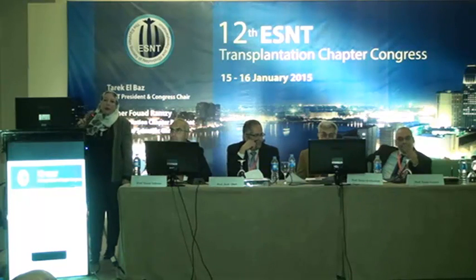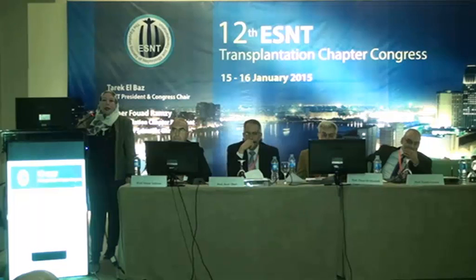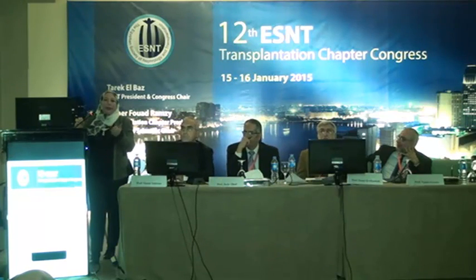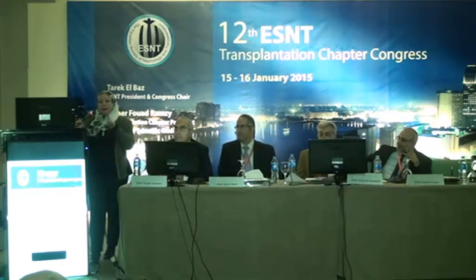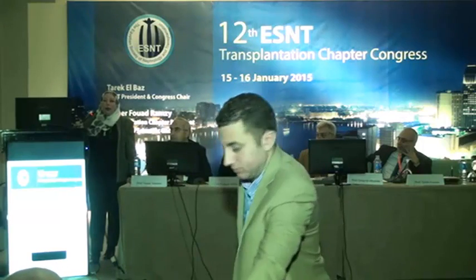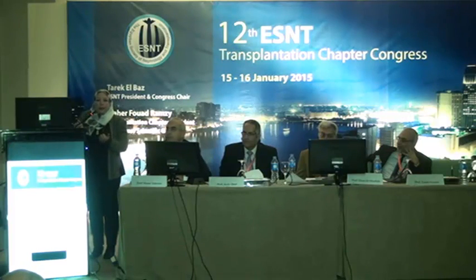But we know now that there are certain cases of antibodies which are not dependent on the complement. Yes. It's not detected by the CDC. It's detected by the flow cytometric cross-match, or can be detected by other methods such as solid phase assay. But the most clinically important is the complement activating antibody. That's why on the Luminex we also have the C1Q assay, in which we can detect the complement activating antibodies.